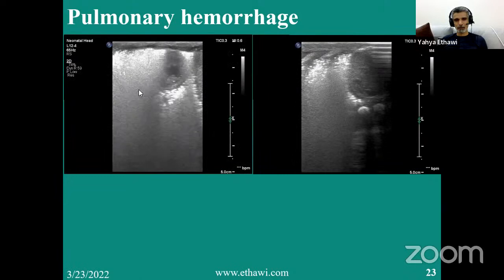So you can see around the heart, but also you can see near the pleura. It's very hard to see where the pleura is. There is pulmonary edema, interstitial edema, and these air bronchograms going everywhere. And there is no boundary of these air bronchograms. They are everywhere.